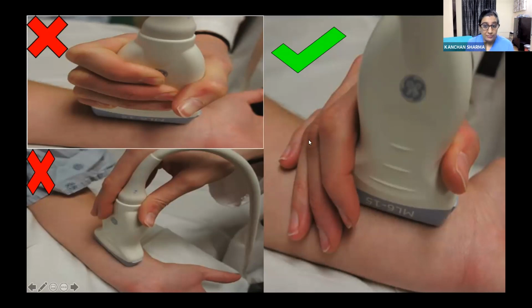Why is it important? Because you have applied jelly, if you're not doing an intervention and are just trying to do a scan. If you don't grip it properly, what will happen? It will keep moving here and there, and you will find it so difficult to hold. So this is the right way to hold it. Please do not hold it like this or like this. That is the wrong way.